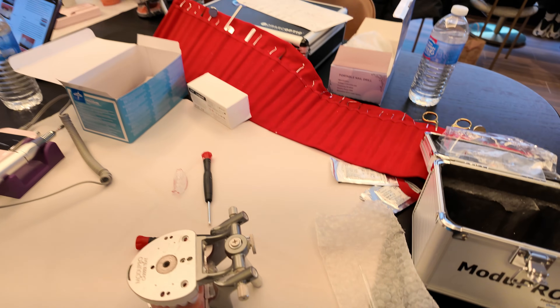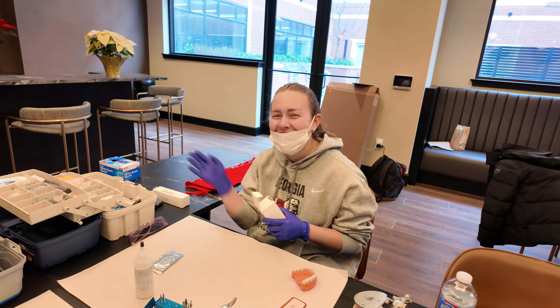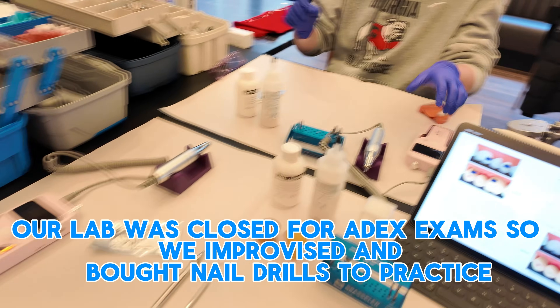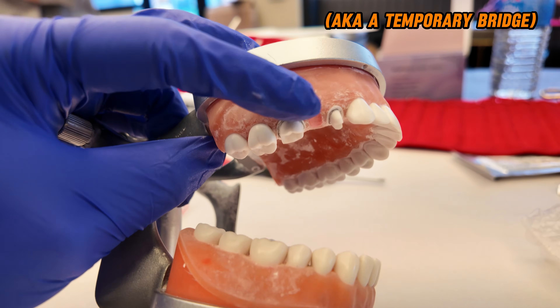We arrived at Medisa's. It's Saturday and we're all dialed in. We got pink nail drills — shout out Amazon. So we're going to make a provisional restoration on teeth three and five. We have our acrylic and our drills.